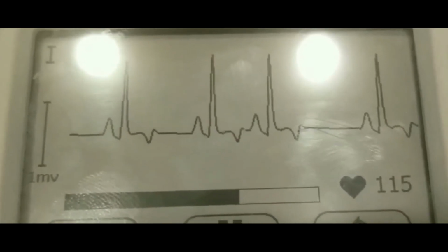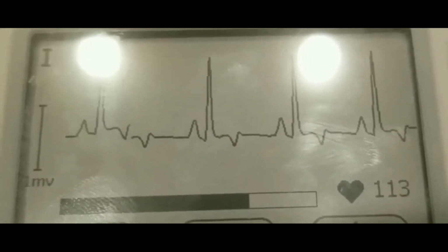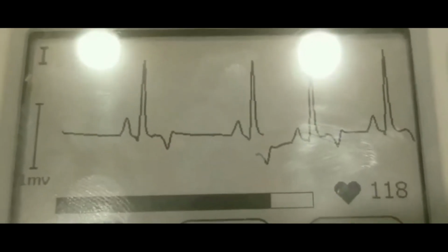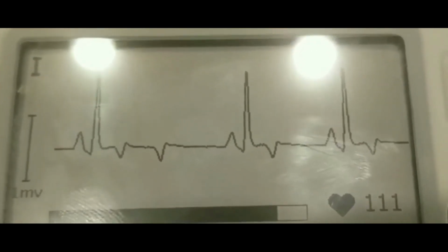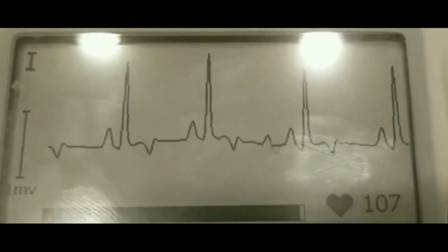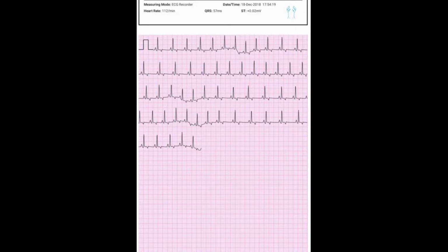The ST segment represents the early part of ventricular repolarization. The ST segment is the line from the end of the QRS complex to the beginning of the T wave. Normally, the ST segment is flat relative to the baseline. Please note that any form of patient movement will distort the interpretation.